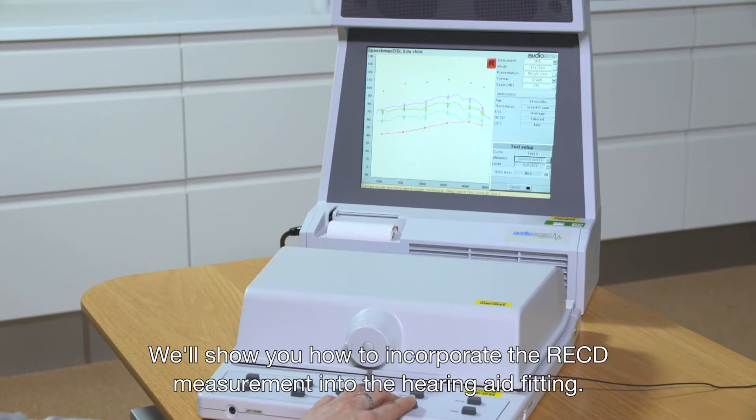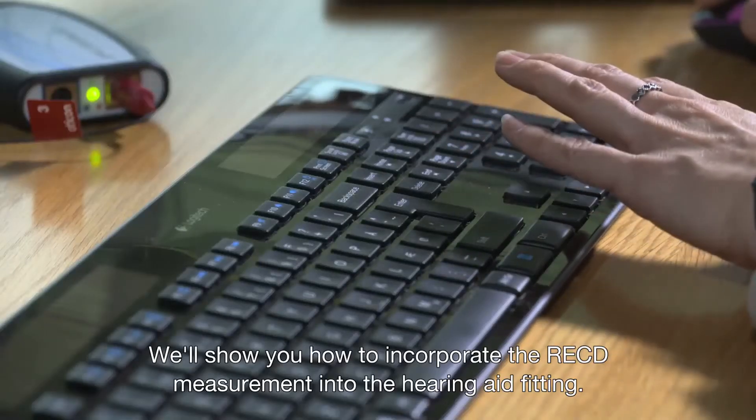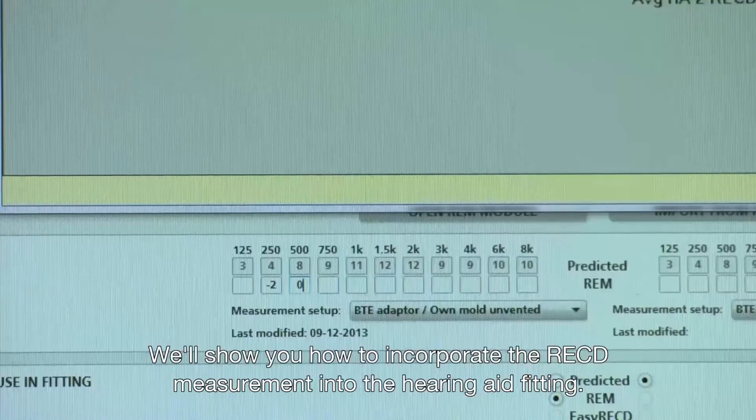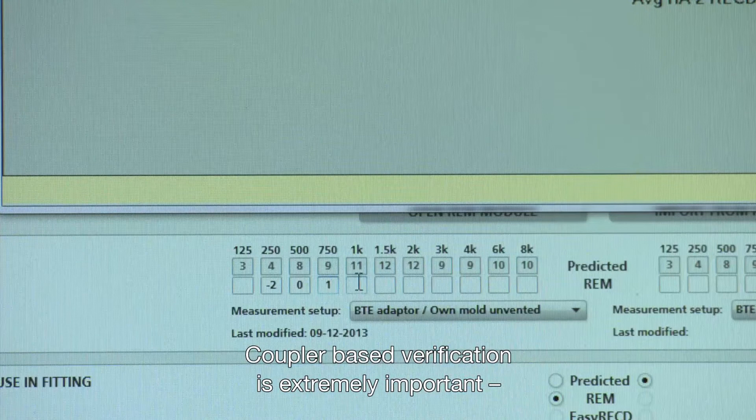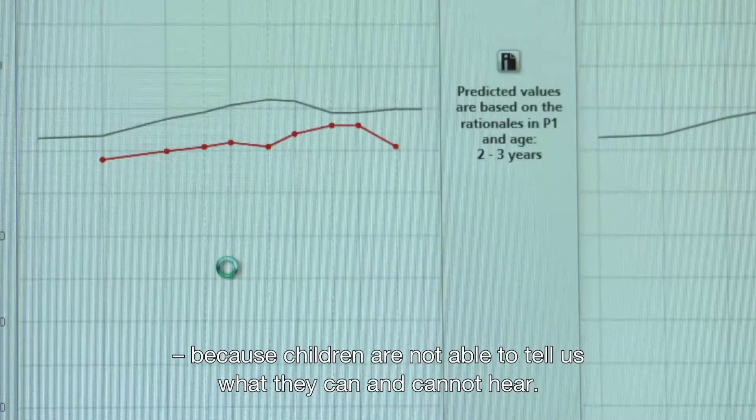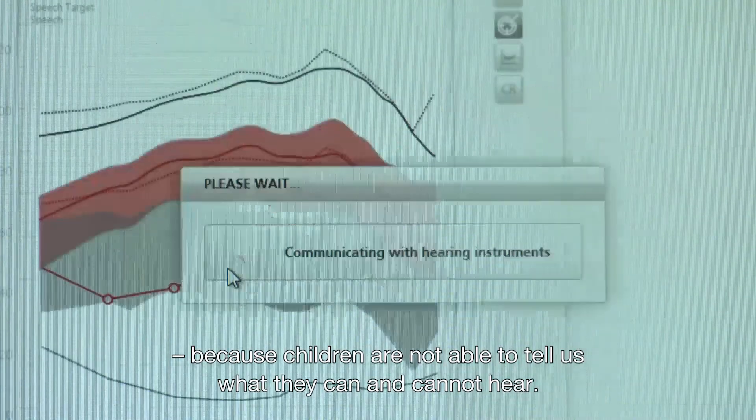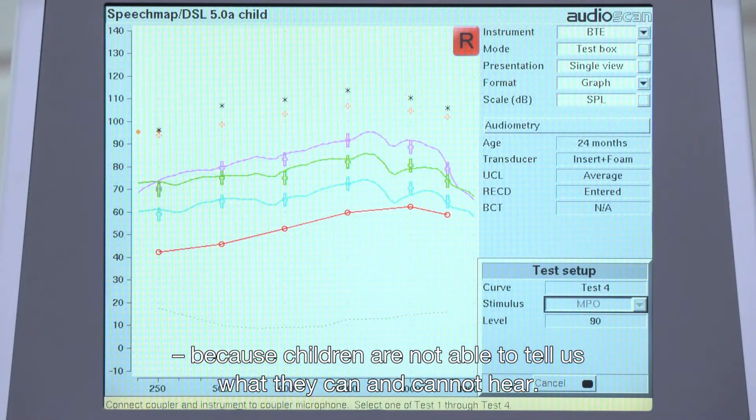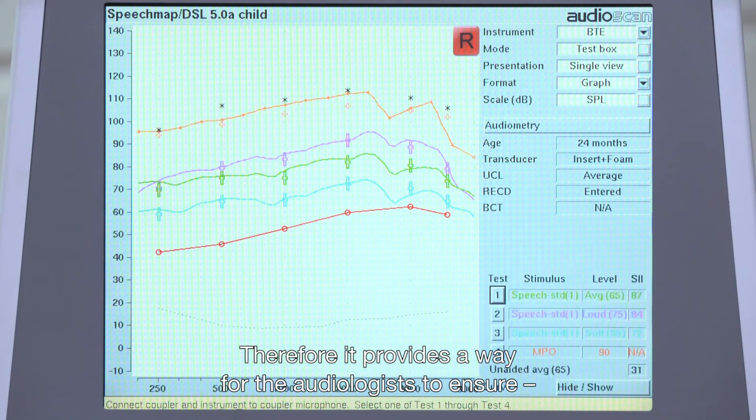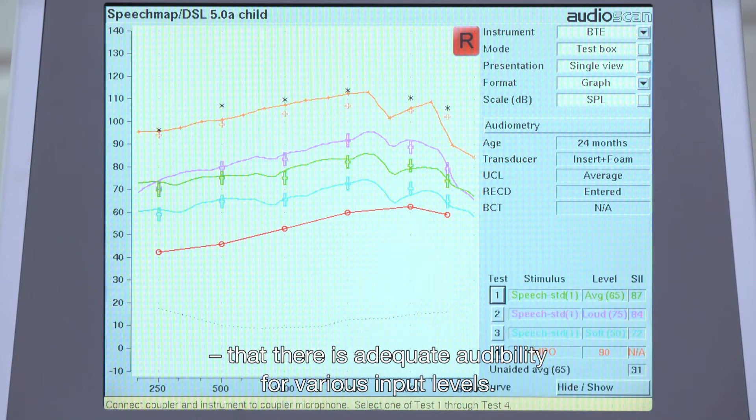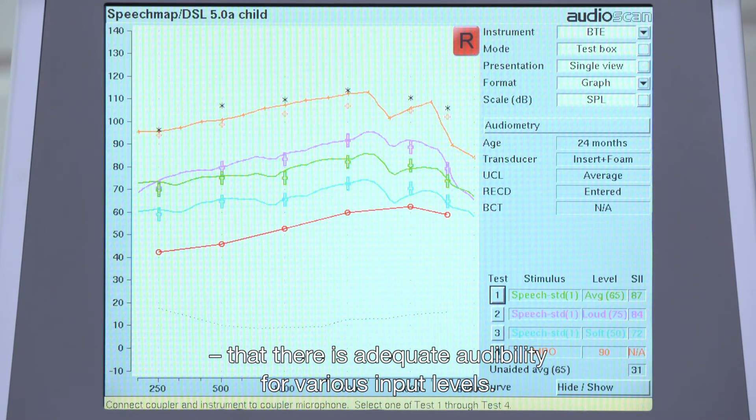We'll also show you how to incorporate the RECD measurement into the hearing aid fitting. Coupler-based verification is extremely important because children are not able to tell us what they can and cannot hear. Therefore, it provides a way for the audiologists to ensure that there is adequate audibility for various input levels.